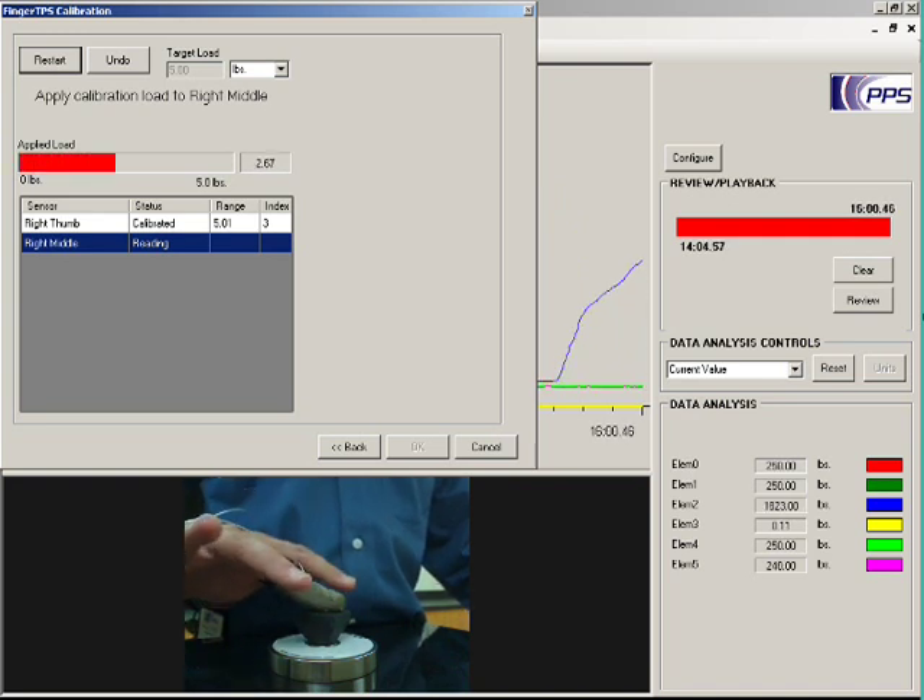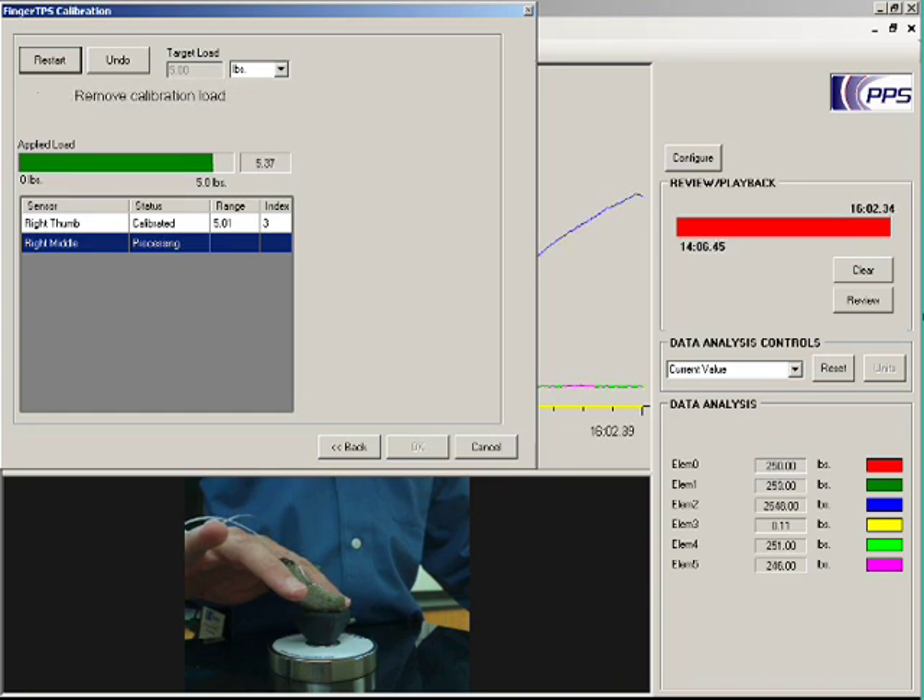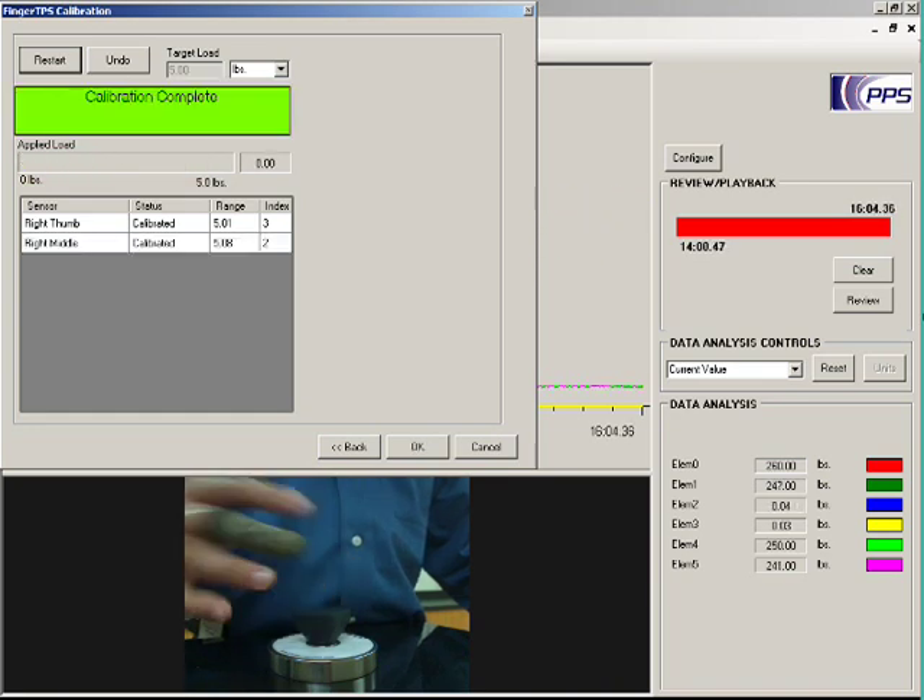Now it directs me to do the middle finger. It should take about two seconds to fully load the reference sensor. And with that, calibration is done, and the configuration is auto-detected.